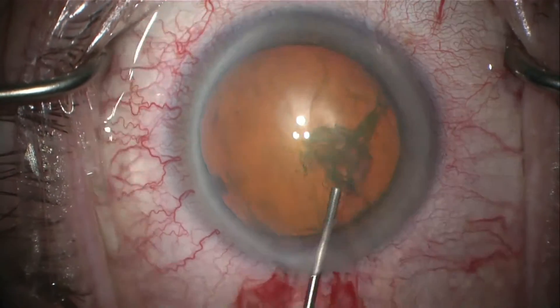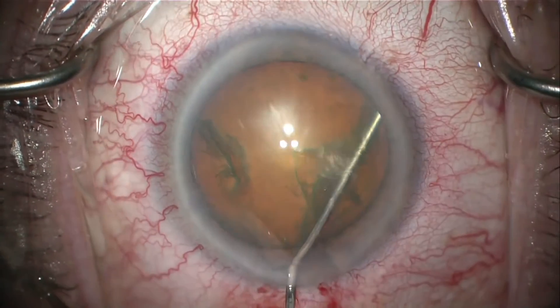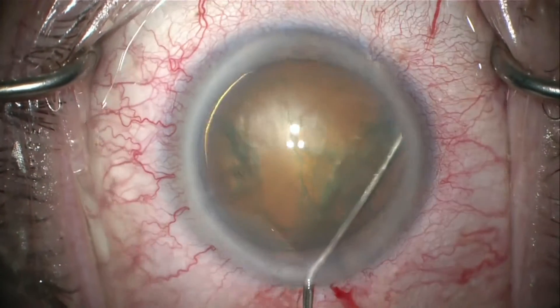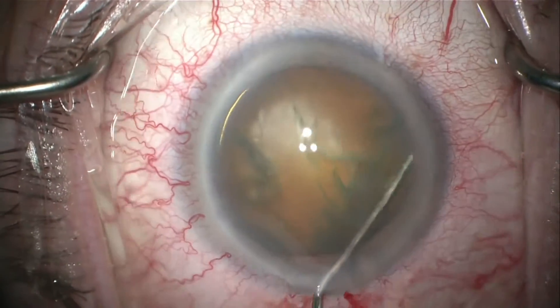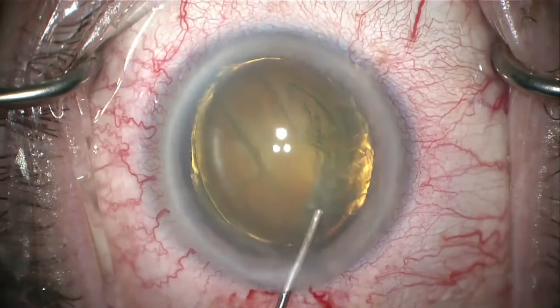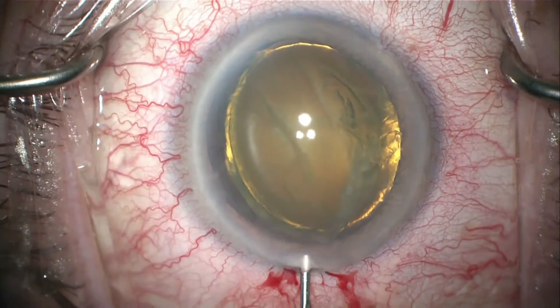I will use hydrodissection to bring the lens forward and prolapse it into the anterior chamber, just above the capsulorhexis margin and to the side of my paracentesis on the left. I will then place some dispersive viscoelastic for added protection.